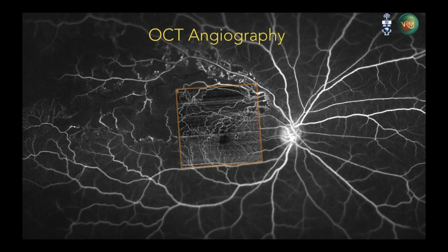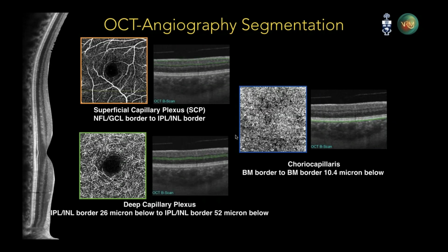And in our practice, we are constantly asking this question and trying to push the envelope forward to have less invasive testing for our patients that is safer, like OCT-A, and see if that can obviate the need for using a fluorescein angiogram.